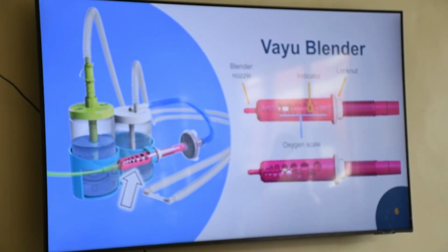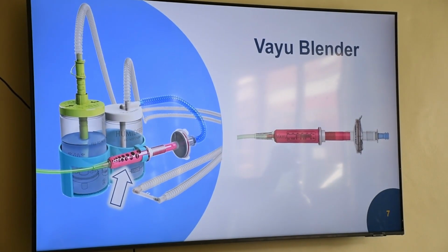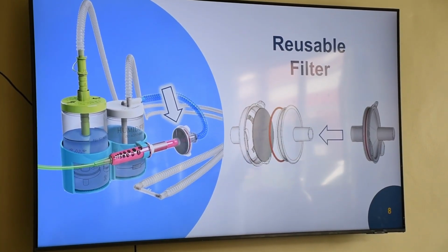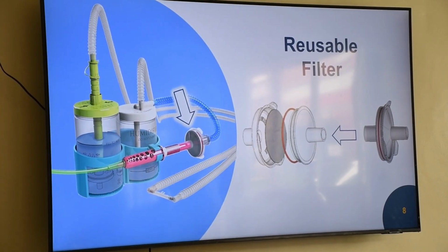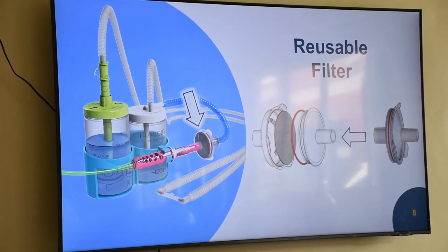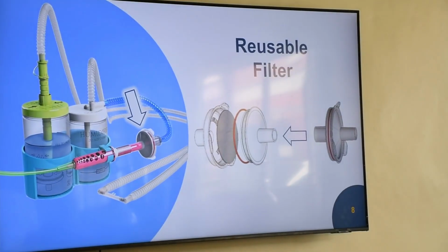This is just a summary of what I was talking about regarding the blender. Then we go to the filter. So the filter is unique in that it's a reusable filter.